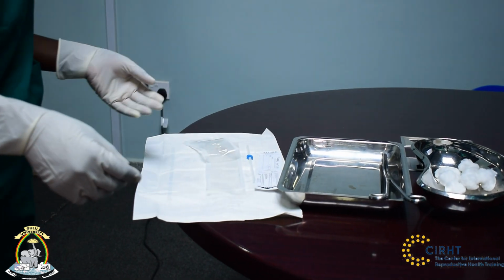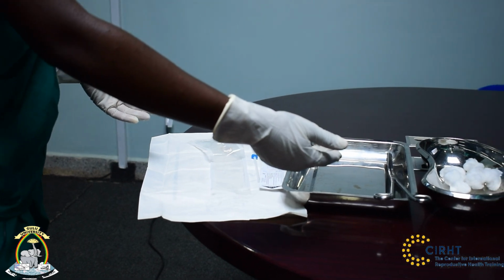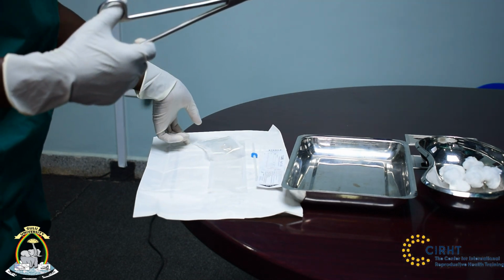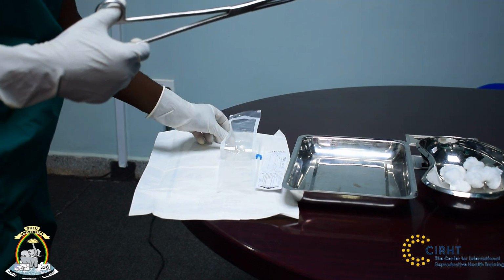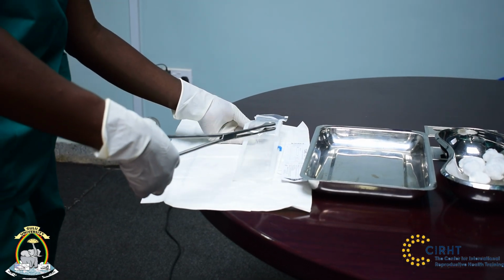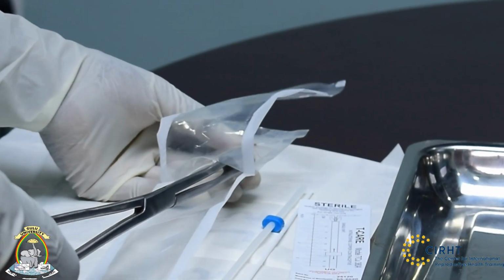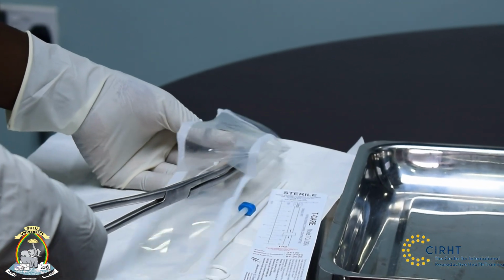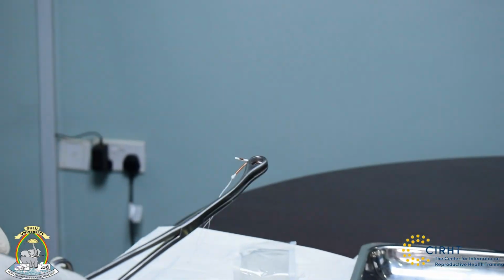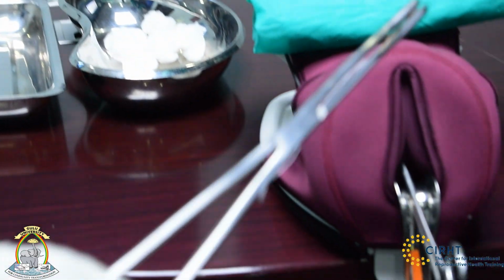All right, so we are going to use our dominant hand to pick the instrument, the Kelly forceps, and open the Kelly forceps. So with our non-dominant hand supporting the package, we will gently pick the IUD from its pack. So we want to pick the arm of the T gently. This, making sure we are keeping the strings and they are not entangled. So we shall gently come and insert our IUD.